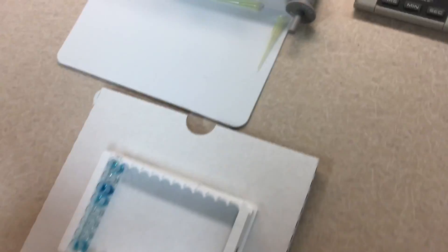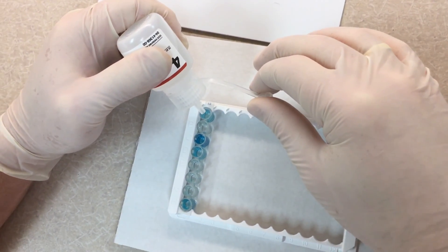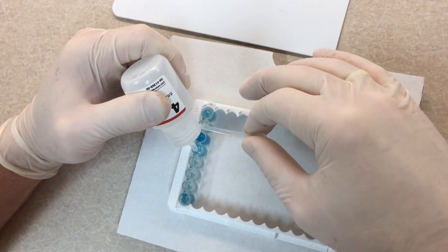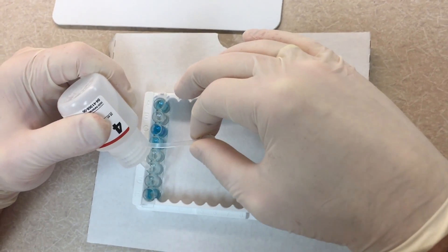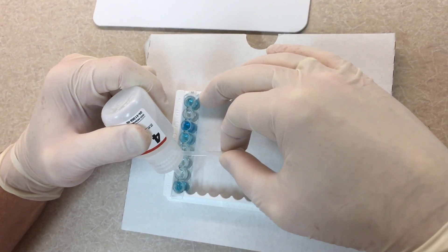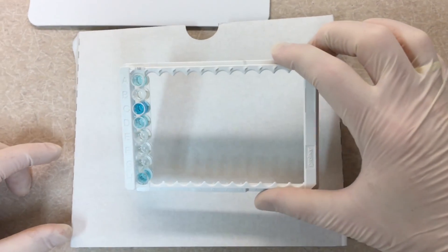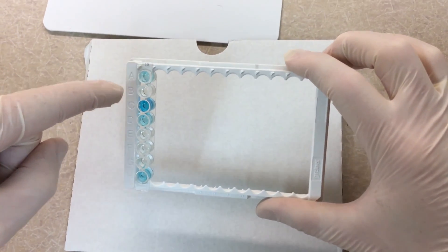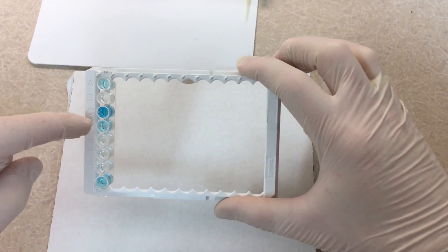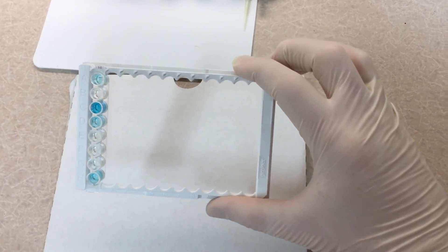After the TMB seven minutes is up, it's time for the stop solution. Put three drops of stop solution into each well — positive and negative controls at the top, then your samples. As you can see, the TMB reagent has turned the pregnant wells blue and left the negative wells clear. The positive control up here is blue and the negative control is clear — any tint of blue is going to be positive.